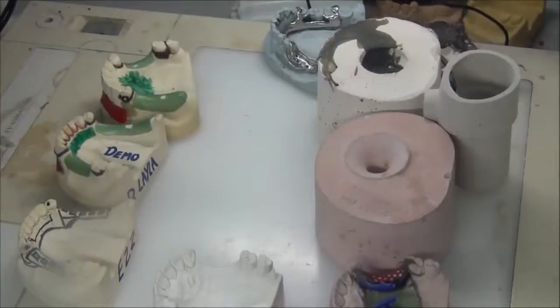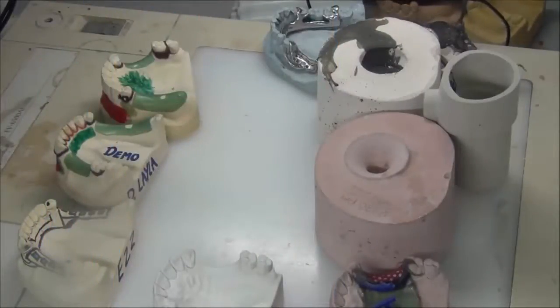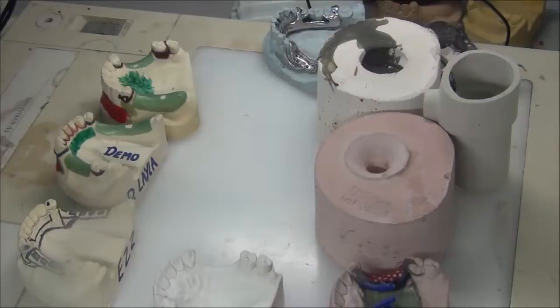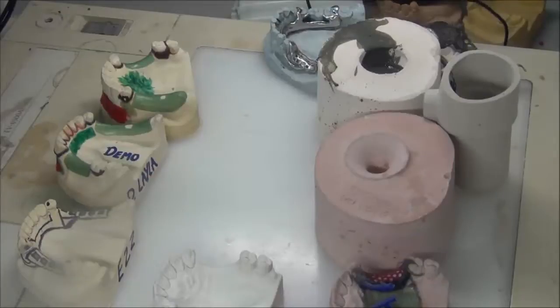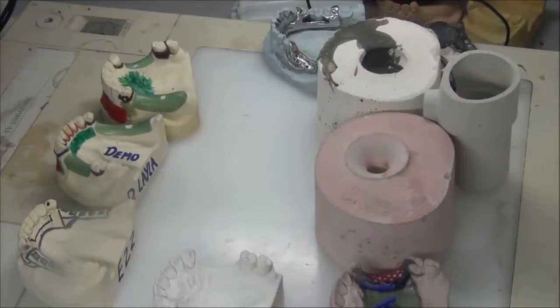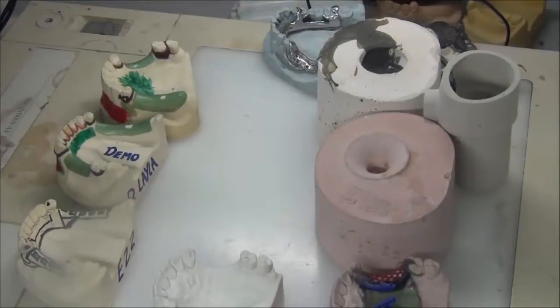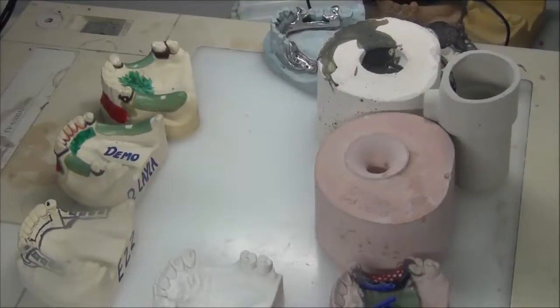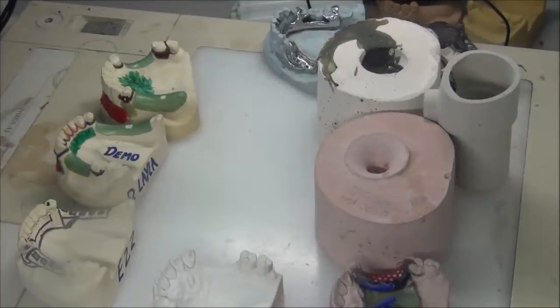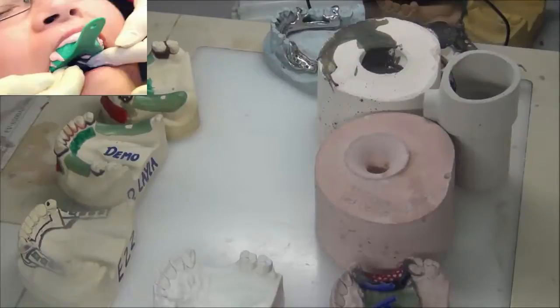Today we're going to talk about lab number two. Lab number two is when you have received, working as technicians, a secondary impression taken from inside the patient's mouth after all dental preparations. So if we revise: in clinic number one we received the patient, made the examination, made all the records we need, and took primary impressions.